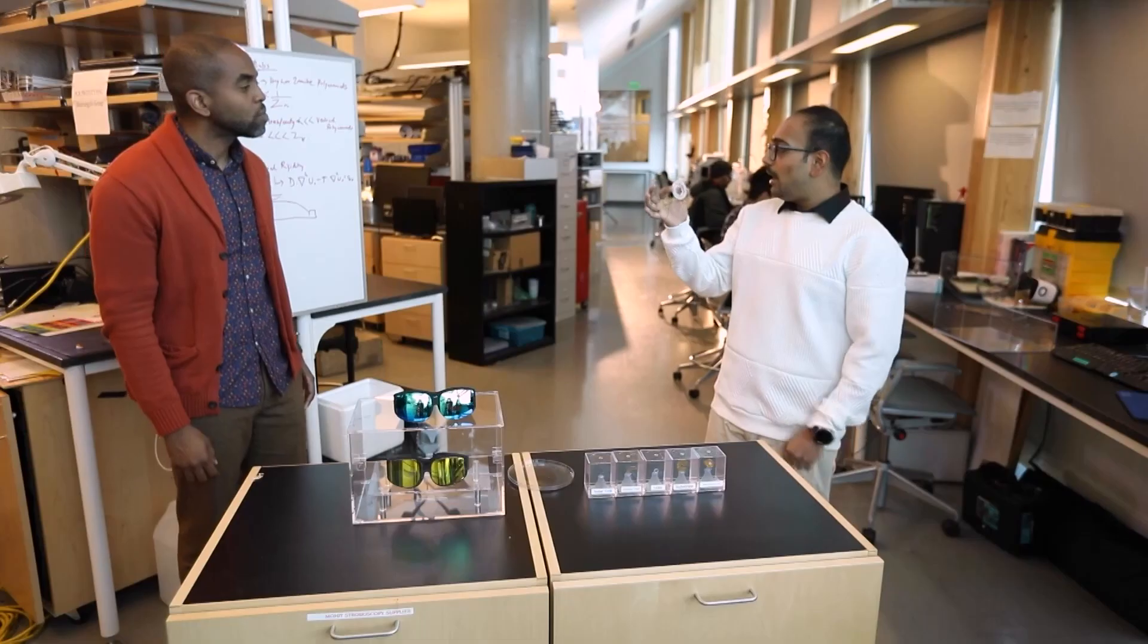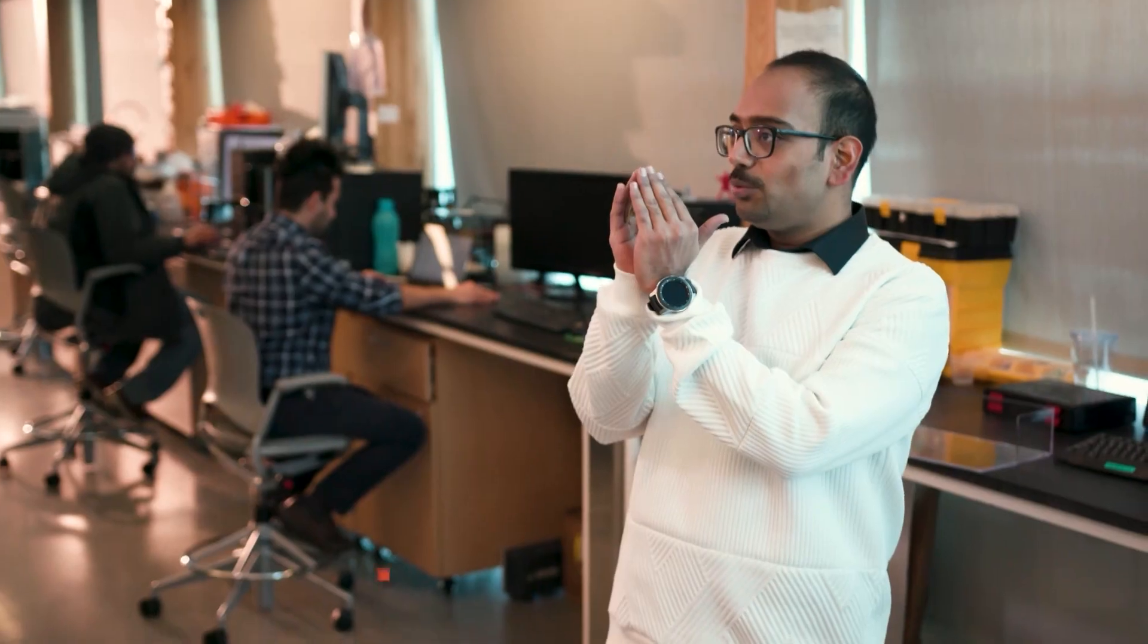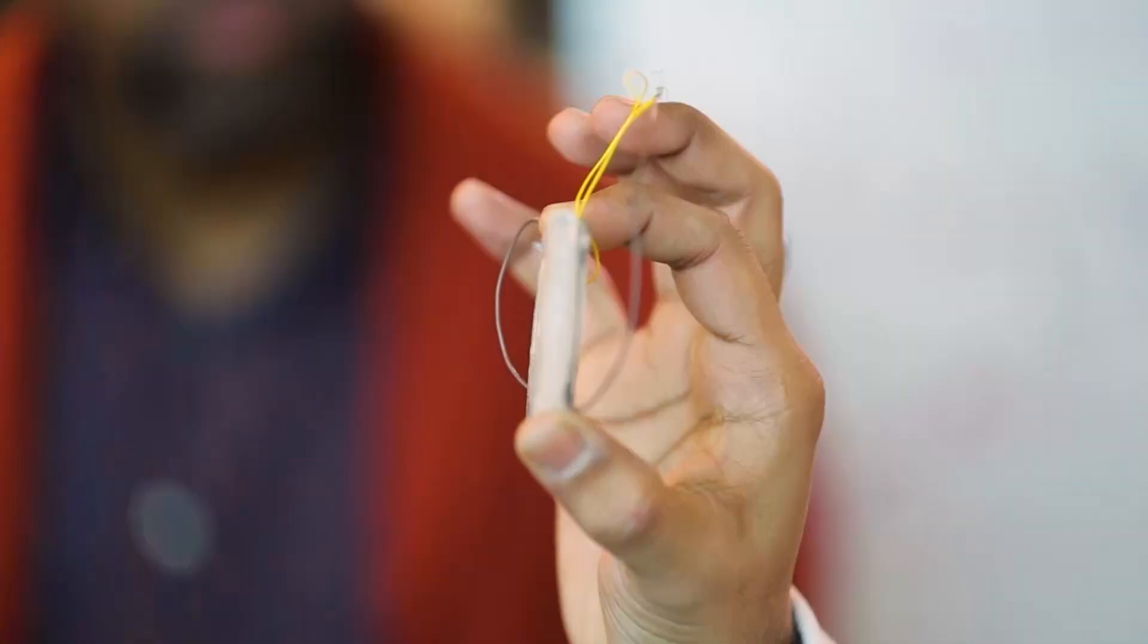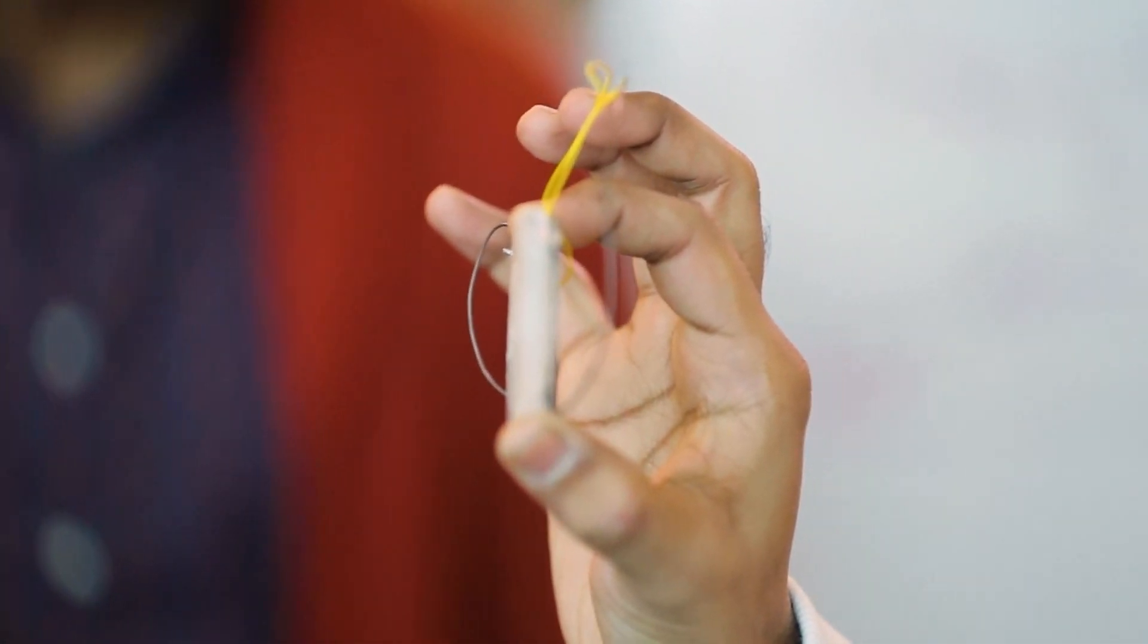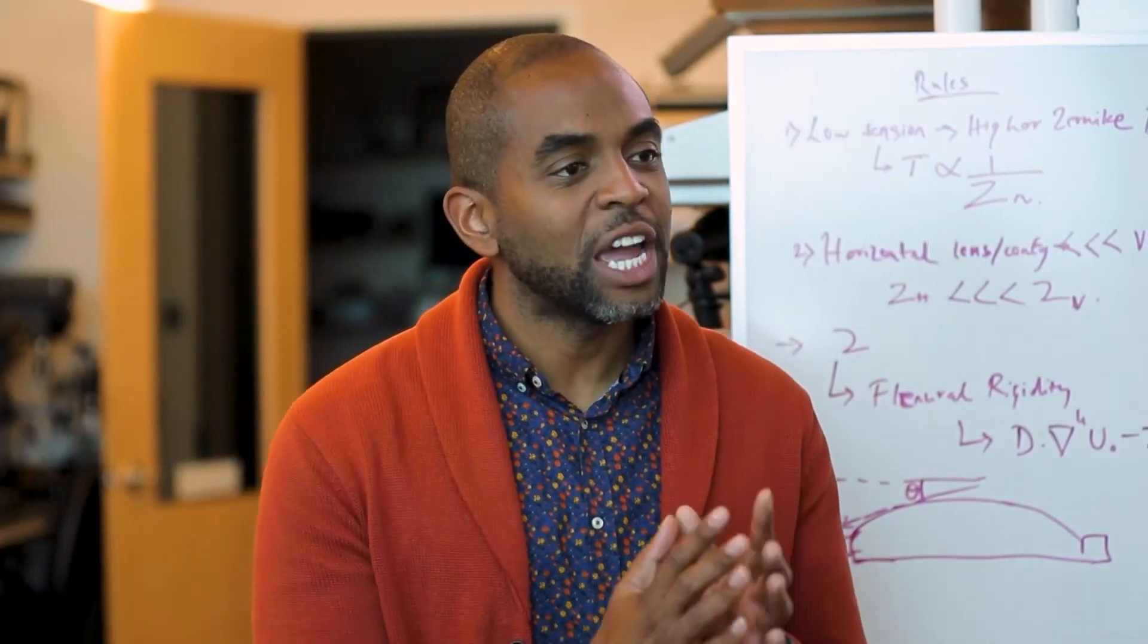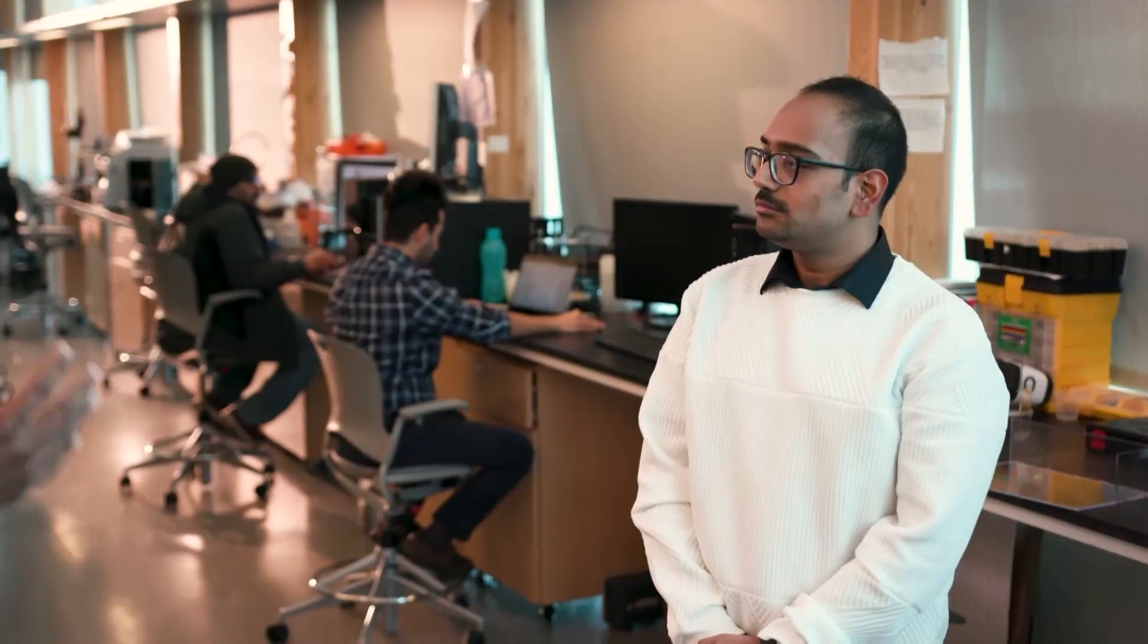Now, these tunable lenses are sort of a pouch which is filled with glycerin. And then there's a piston attached which pushes the glycerin in and pulls the glycerin out, which changes the shape of the lens and allows us to control the power of the lens. And the reason that we want to change the shape of the lens is because we're adjusting for different focus. That's correct.